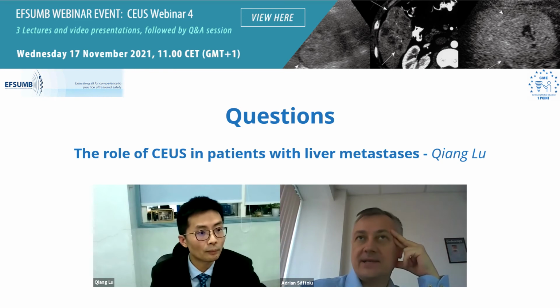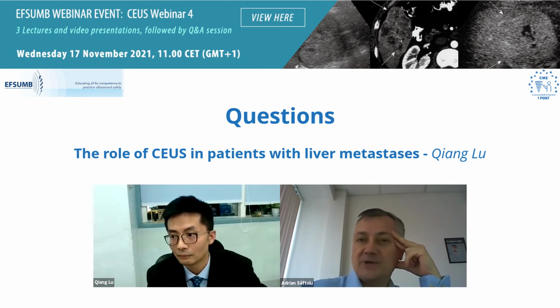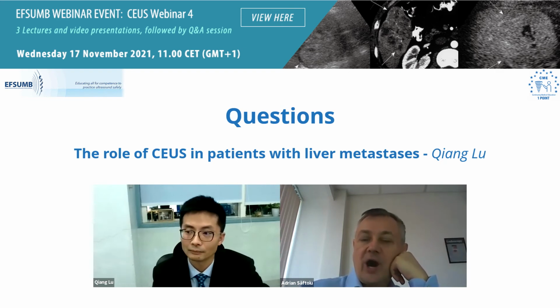It was an excellent presentation. Congratulations. Really nice images. Are you doing contrast for all the patients with a suspicion of metastasis, or for all the oncological patients, or not? How do you proceed with the patients? Are you waiting for CT when you are following up, or are you doing contrast-enhanced ultrasound, CEUS, directly?